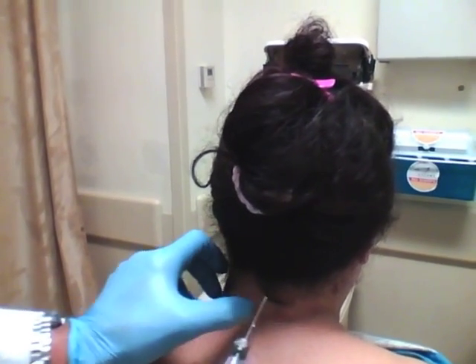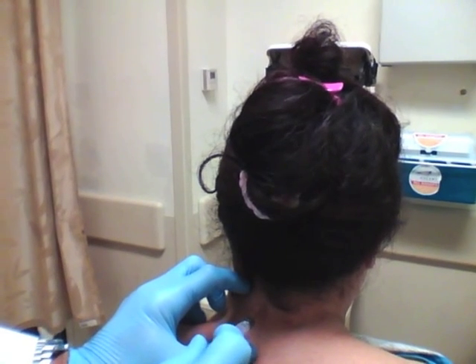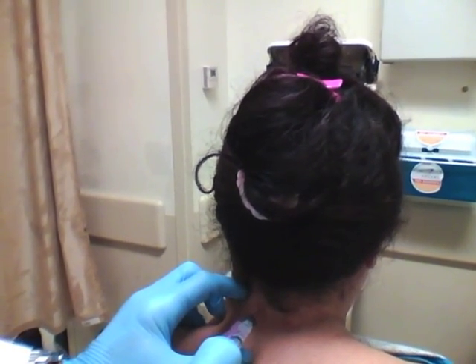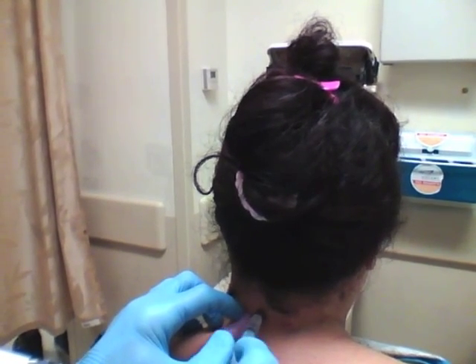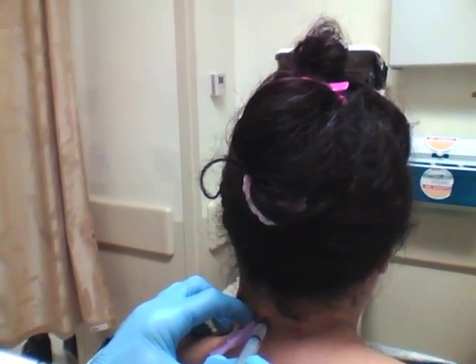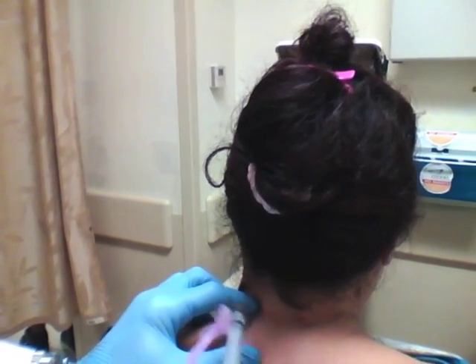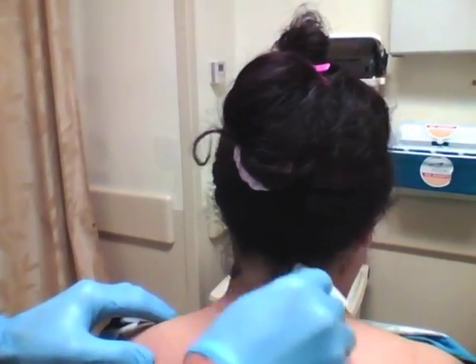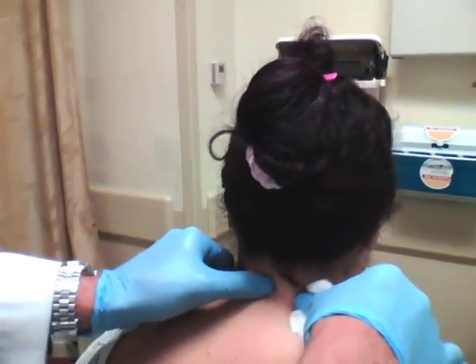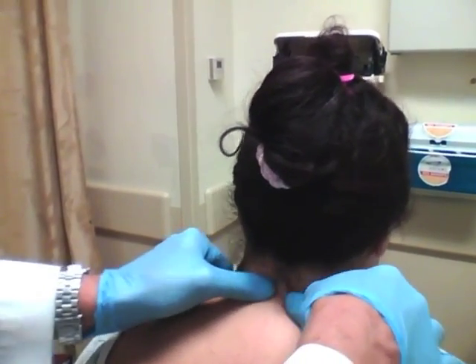Again, feel for my landmark, come over just about an inch to an inch and a half, aspirating as we go in — we're in the muscle. We're going to put a cc and a half of bupivacaine in there and that's it. Massage that around a little bit so it gets in there. I have a feeling it's the massage more than anything that makes the headache go away.